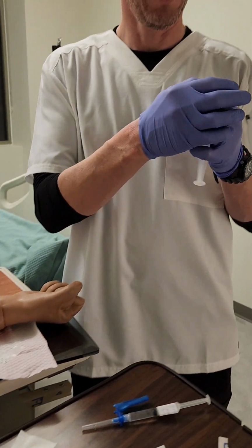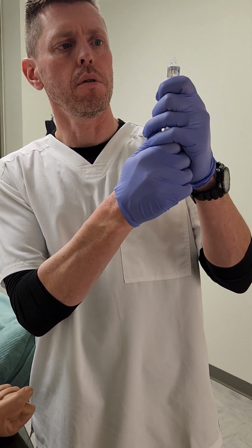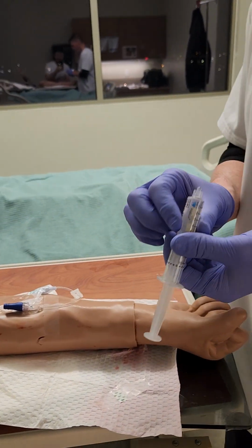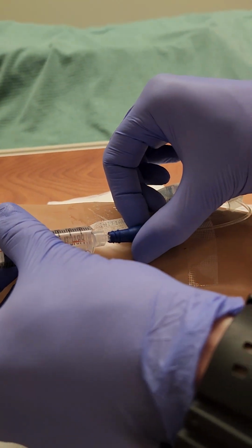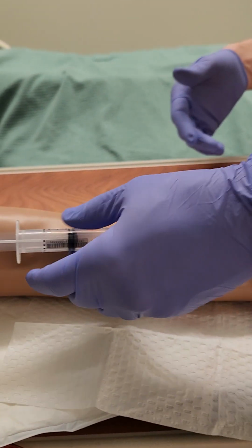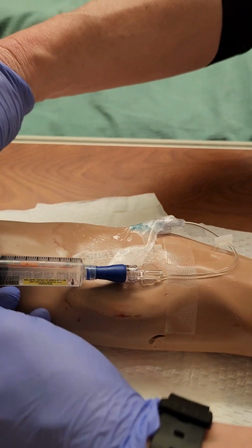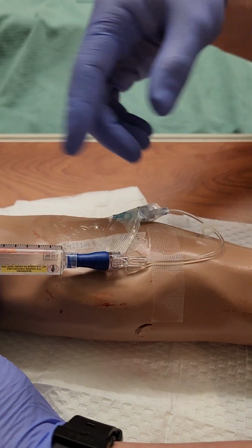And I'm going to take the lid off there, pull back on it, push back to get the air out of it. I would connect this to here so that I can make sure that this line is still good. So I want to go ahead and flush it, and if I'm flushing it, I also want to make sure that there's no infiltration.